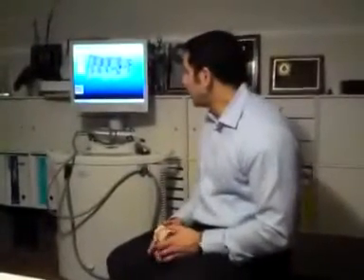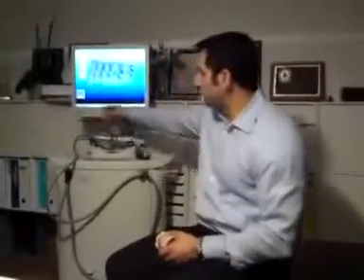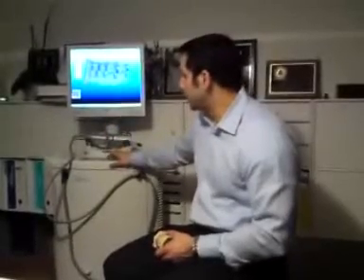And the file size of the files you send? The initial file here, this would be around 12 gigabytes of information, which is massive. So that's why it's processing, and then what it's doing, it's going to strip it down to about 12 megabytes. Okay. And that's what's going to be emailed. Then we refine it again and then compress it again to about 2 or 3 megabytes, depending on the size of the case. So that's generally how big the file is in the compression process.